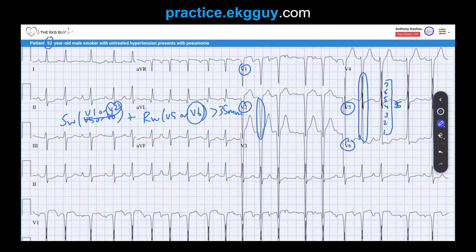Non-voltage LVH criteria include left atrial enlargement and left axis deviation, though these are not essential. In this case, full left axis deviation is not present. Other features include non-specific intraventricular conduction delay, delayed intrinsicoid deflection where QRS onset to R-wave peak is more than 50 milliseconds, and small or absent R-waves in V1 to V3 — those low anterior forces.